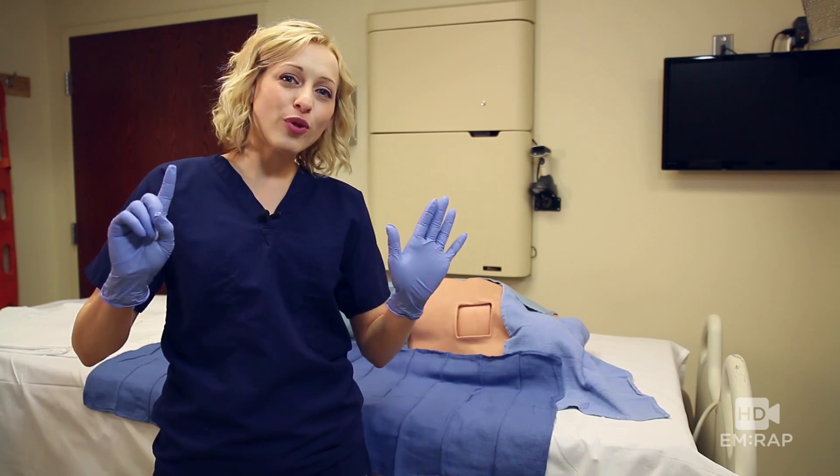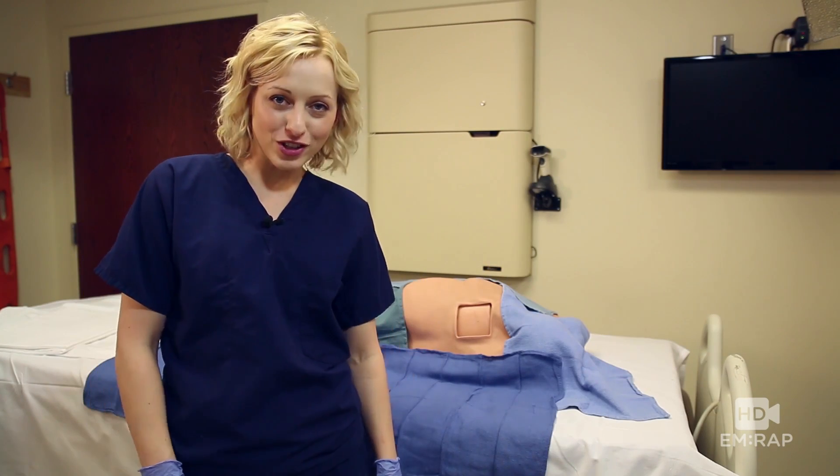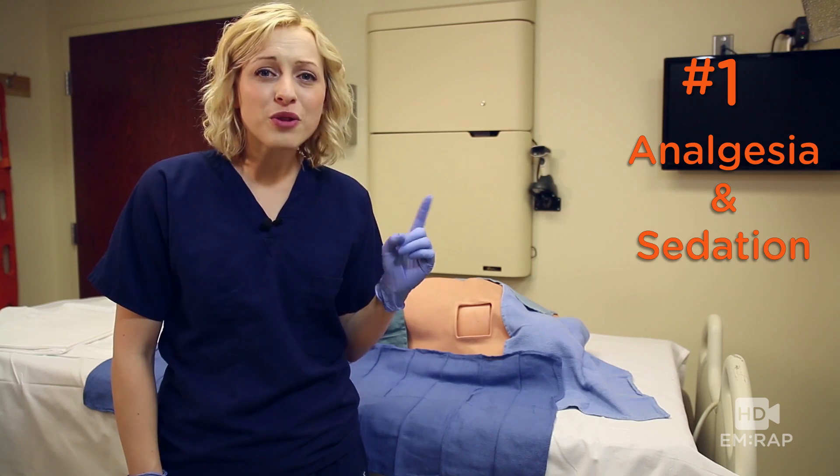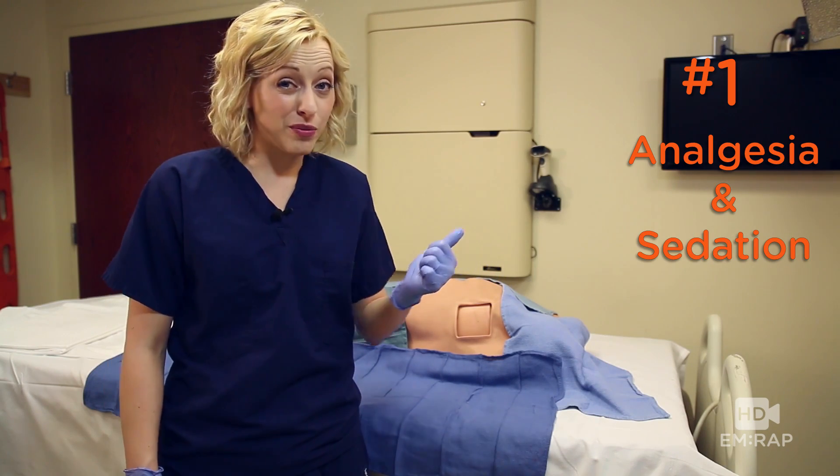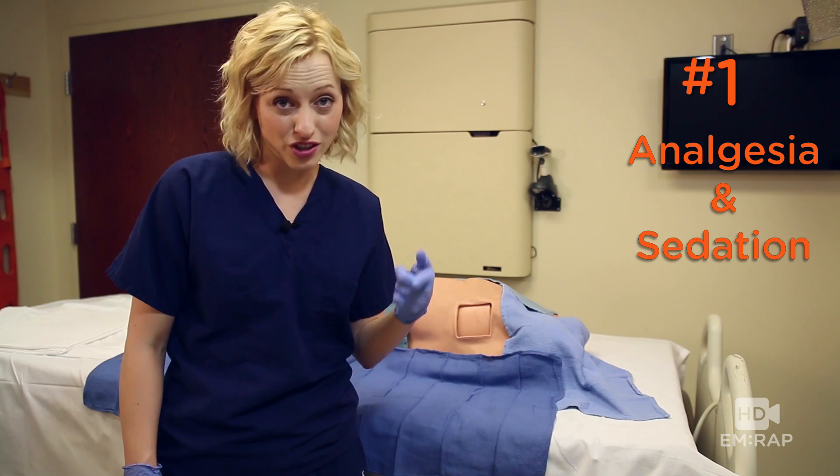Dr. Mason here with six tips for chest tubes in obese patients. Number one: make sure their pain is well controlled and they're adequately sedated, because if your patient's uncomfortable, you're going to be uncomfortable.